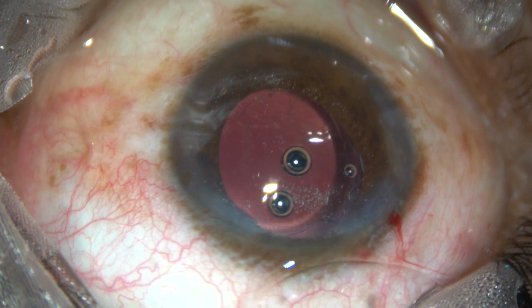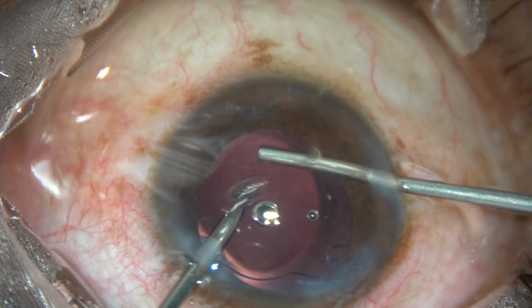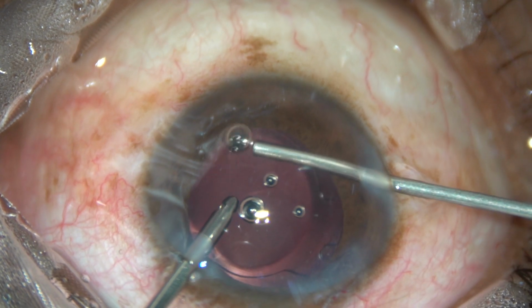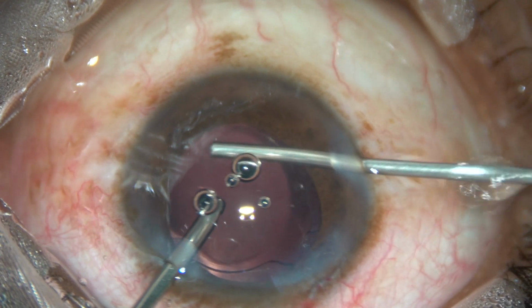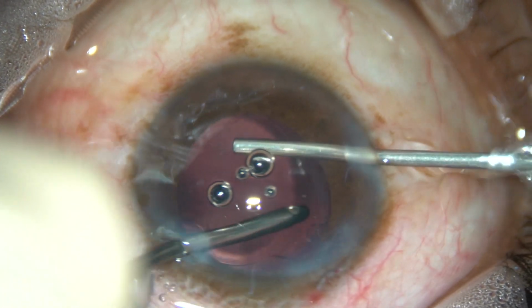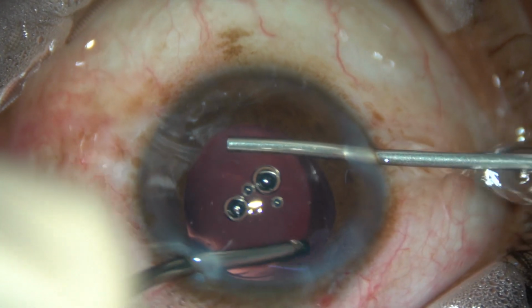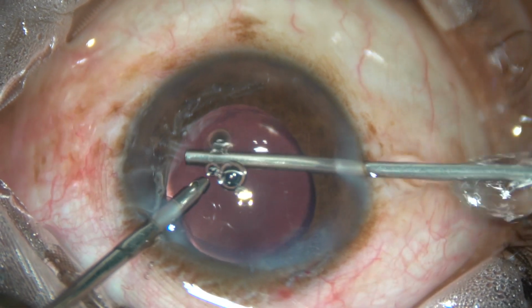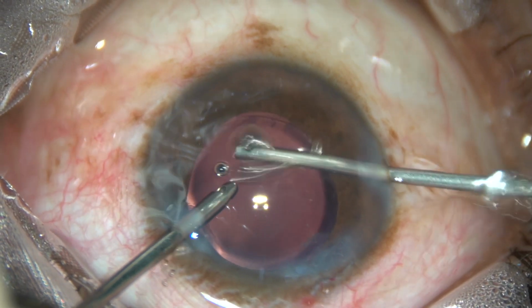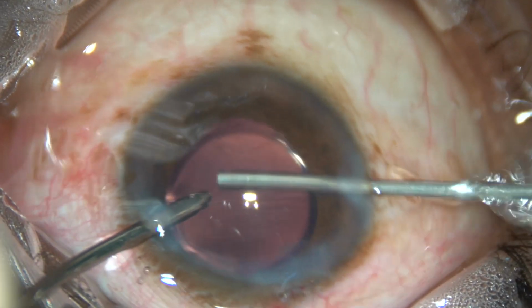So I have asked for the vitreous cutter, and I am using the vitrectomy cutter to trim the vitreous strands. And now I am going to place the intraocular lens in the bag. What I am going to do is I am going to dial the lens and place it in the capsular bag.